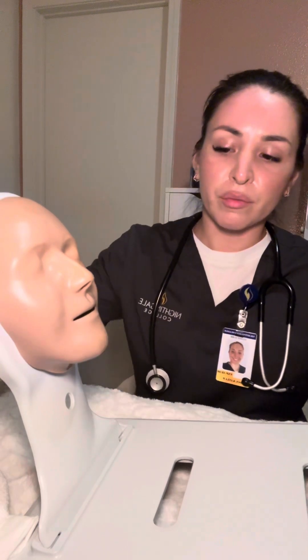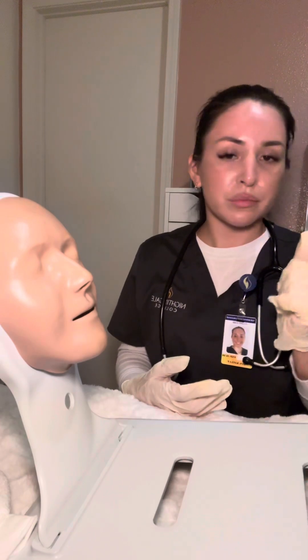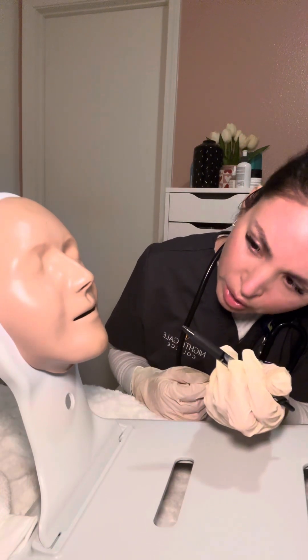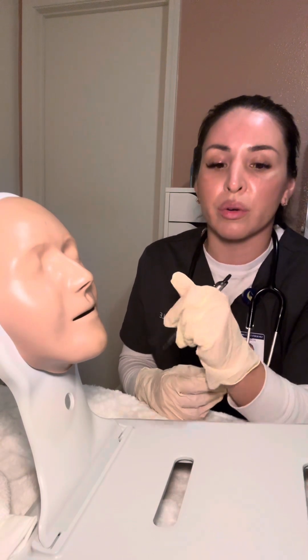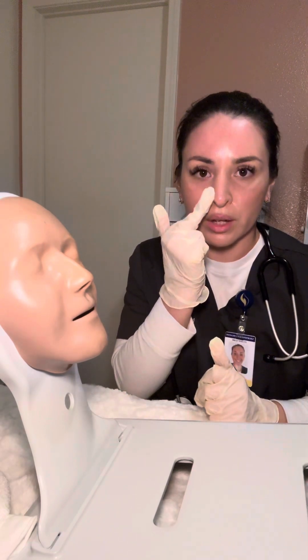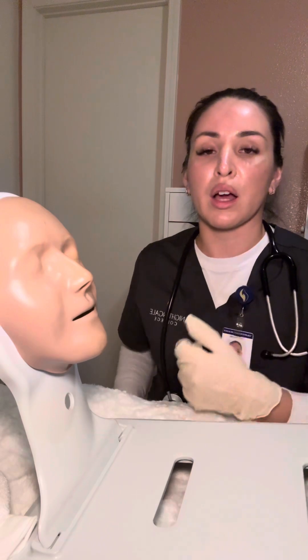First I want to assess the patient's nares. I'm going to get a pen light, ask them to tilt their head back, and check both nostrils for any abrasions, making sure the skin is intact with no irritation. I'll also ask them to hold one nostril and breathe, then hold the other nostril and breathe — whichever has better airflow is the nostril I'll choose to insert the NG tube.